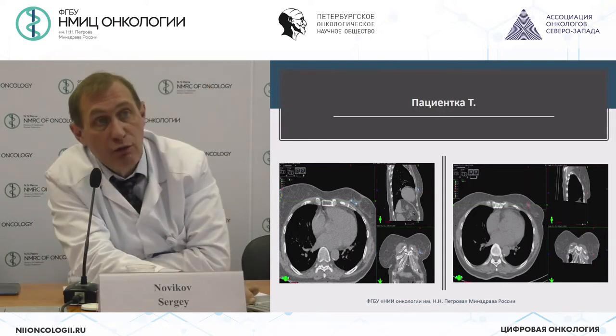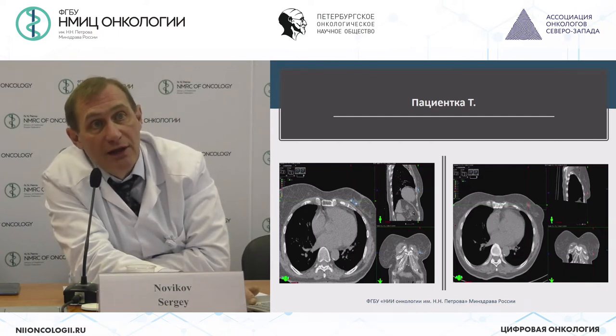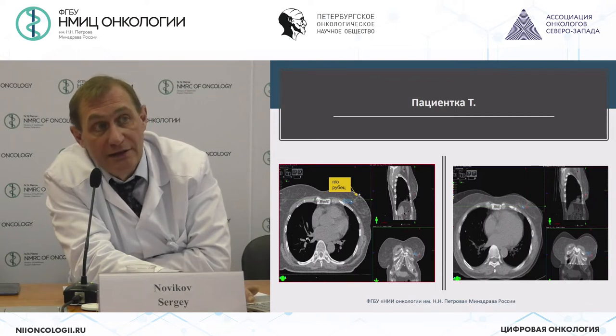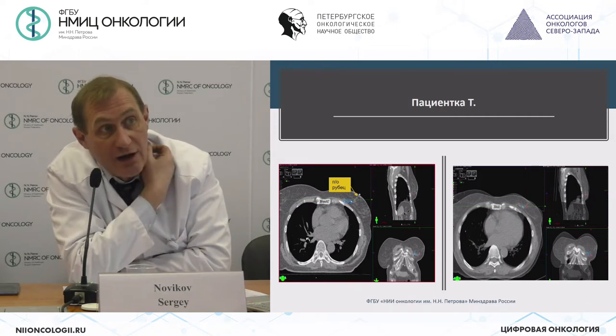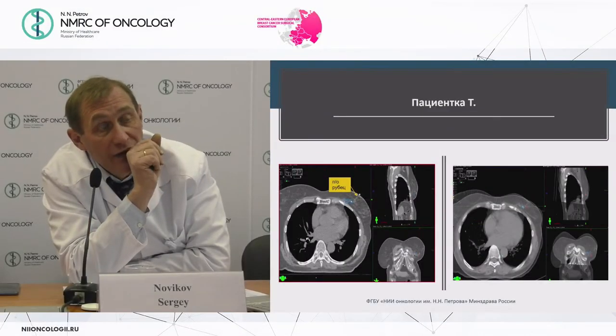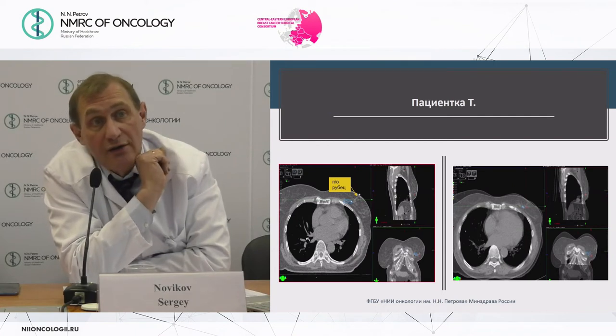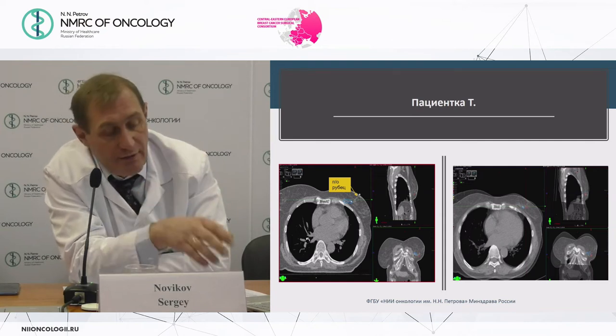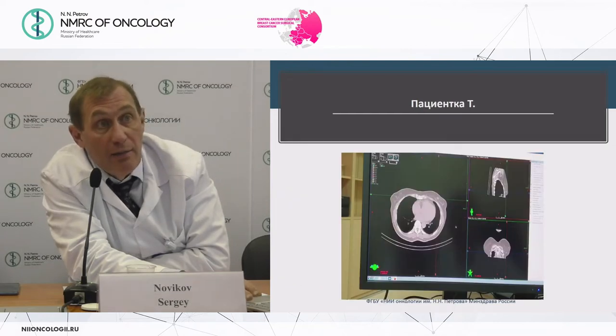You see in this woman, the clips and the tumor are more or less in the same position, and it is also not a very complex problem to plan this lady. We also see the scar perfectly, and of course during GTV drawing, we include in the tumor all clips except the clip which is lying on the muscle, because it is only for positioning. And we try to include the whole scar to the level of the tumor. Of course, we are sparing the skin.